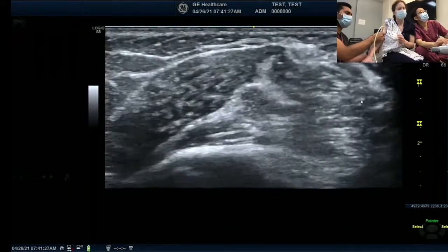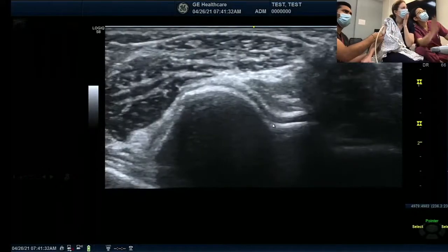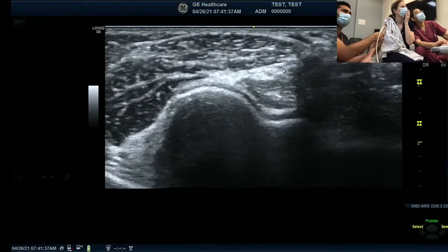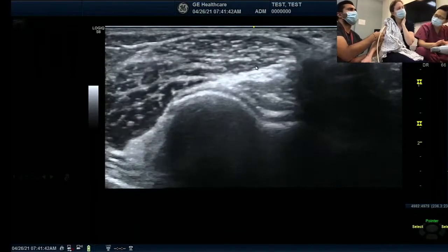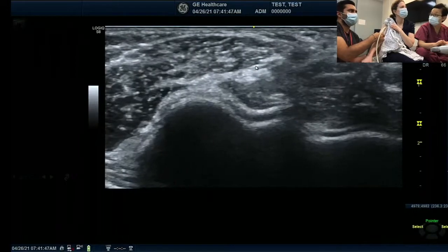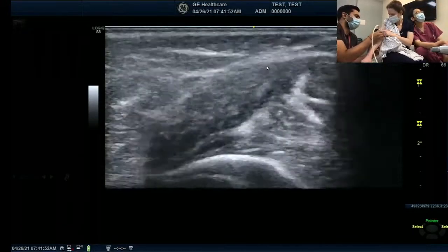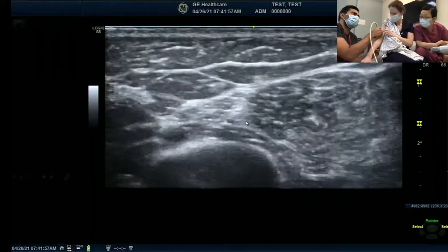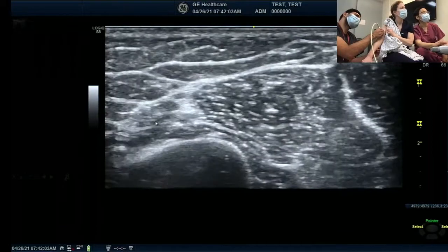Let's go to home base to find the superficial branch. Can you toggle a little bit and clear which one is the superficial branch? I feel like all these things are the deeper branch. It's not the deep branch, but the nerve to the brachioradialis, ECRL, ECRB. That's what we are seeing without seeing the superficial branch. Go up here and see from where it comes. Where are you? Like above. You are still in the brachialis and brachioradialis.